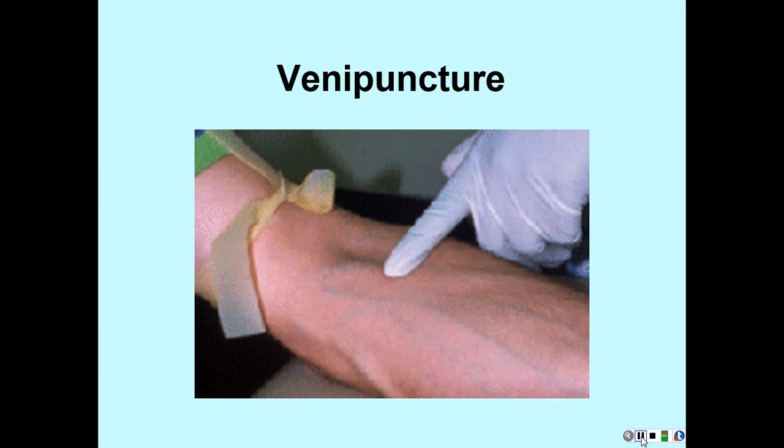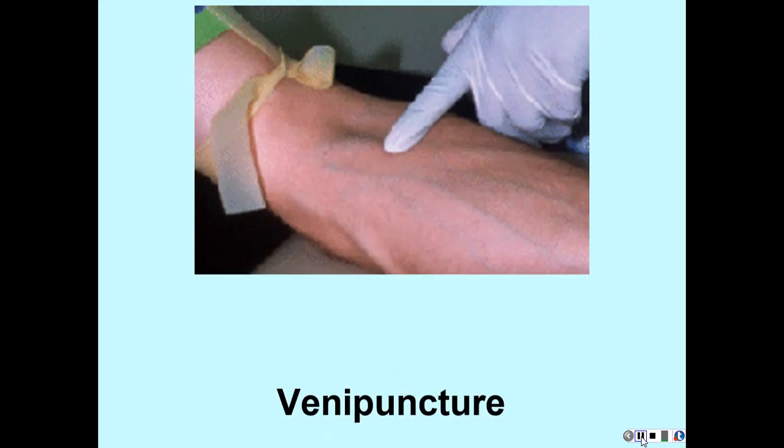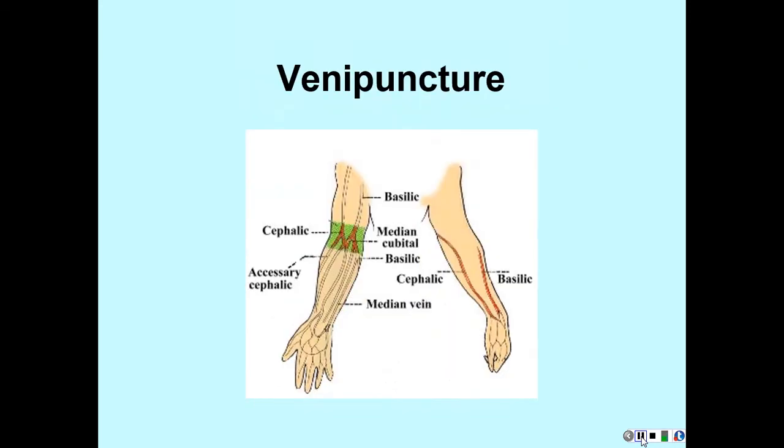But you don't want to disconnect an IV, pull blood, and then reconnect your IV. You don't want to do that. You want to get it on the initial start of your IV. And then blood draw after that should be done through another vein or through a different lumen if you have a dual lumen or triple lumen catheter. But plain old blood draws, we're going for the antecubitals.